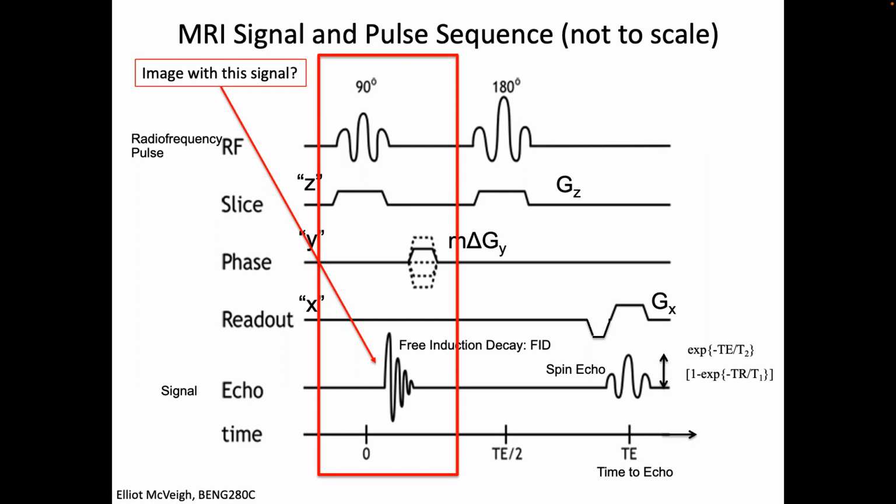And so that was one of the things that occurred in the technology: the amplifiers and the gradient design. The self-inductance of the gradient coil was reduced. The amplifiers got a lot bigger so that these ramps could get really short. Ideally, this ramp here would be a vertical line, right? I don't want to spend time managing magnetization, pushing it around, and switching my gradient amplitudes such that I can't sample the signal here. I have to wait till it becomes constant to sample the signal. So you'd like to just switch them off.